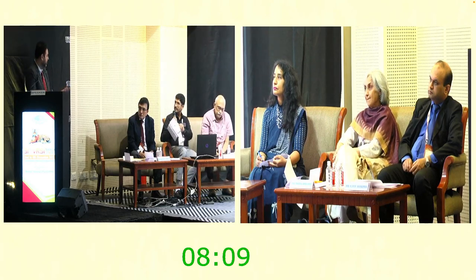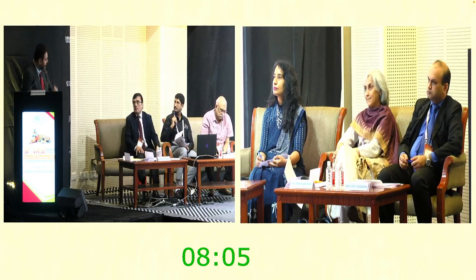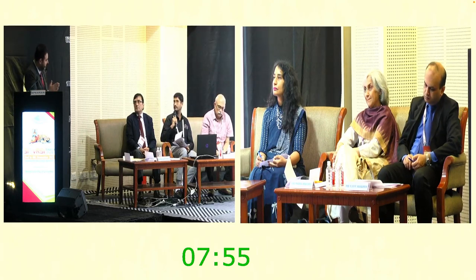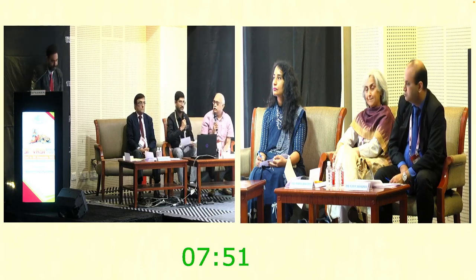Okay, so no surgery related complications in these patients? No, none. I had a retinal detachment in my last one, and that was because the hyaloid has to come off anytime we want to get into the subretinal space. So I had a PVD induced horseshoe tear in the periphery, which I missed, and that's what caused the retinal detachment later on. I had to fix it. I'll open it for the judges now.